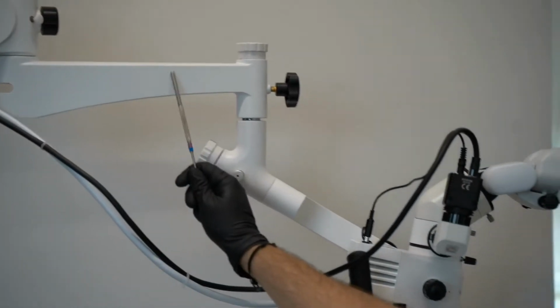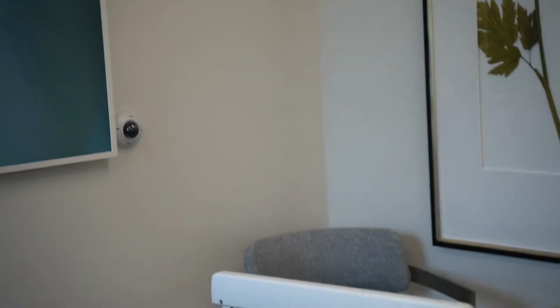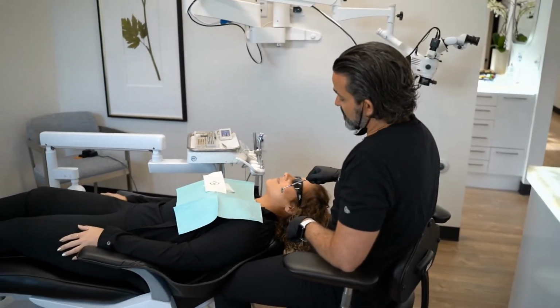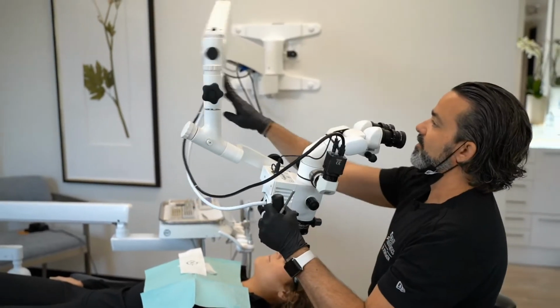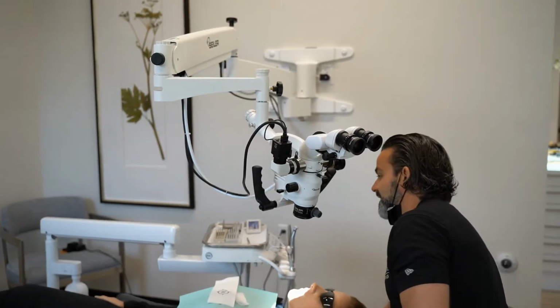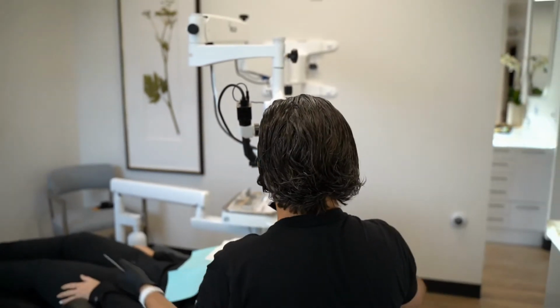There's also different lengths of this arm, and this is kind of extreme because even though I always preach working in 12 o'clock, when I'm doing an apical surgery, I'm bending the chair. Let's say I'm working on the lower left quadrant, and this is the only time I break from 12 o'clock as an endodontist, especially on a lower mandibular apico. And so I'm going to want this extra reach and a kind of kickback. I really appreciate this lower arm right here as I'm coming around like this. If my chairs didn't swivel, and I'm sort of locked in place, then it even becomes more of a stretch. And this is where we would come in like this.